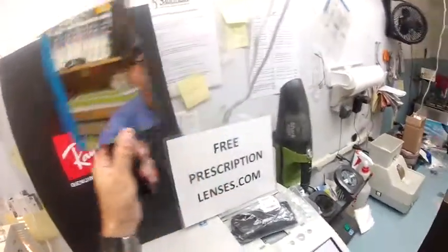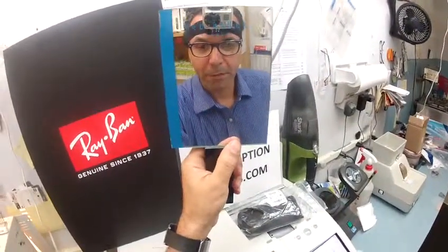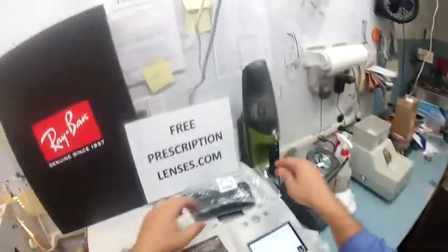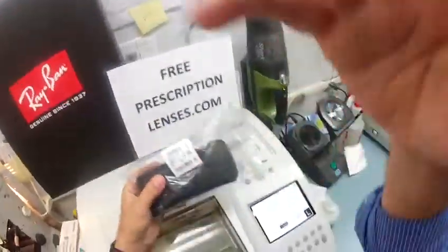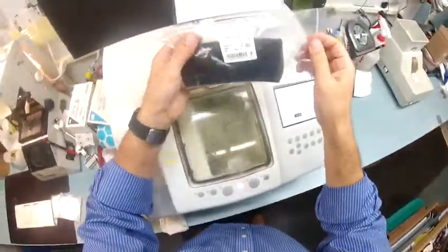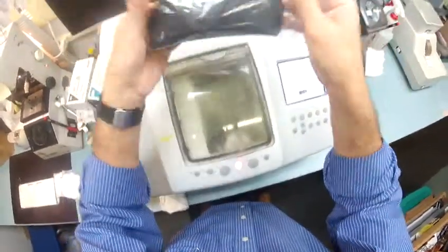Hey, Tabitha. Matthew here with freeprescriptionlenses.com, and I'm going to show you how your Ray-Ban 5121 is going to look with transition gray lenses. I'm going to cut these right before I go on vacation. Don't worry, I can make you and the wife happy, so everyone's a winner. Let me pull this down so we can see what we're doing. This is your Ray-Ban 5121, color 2000, size 50.